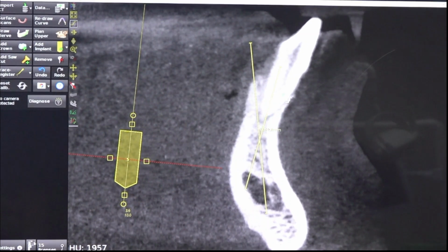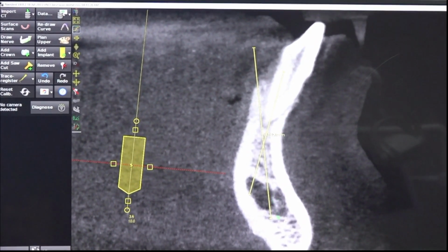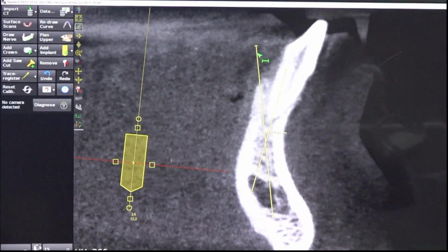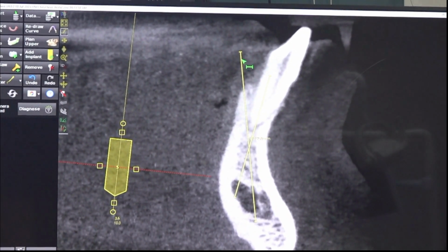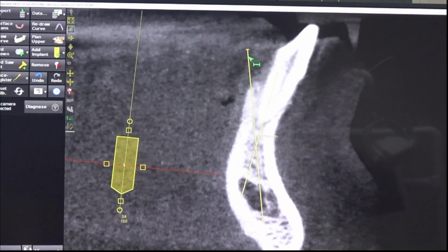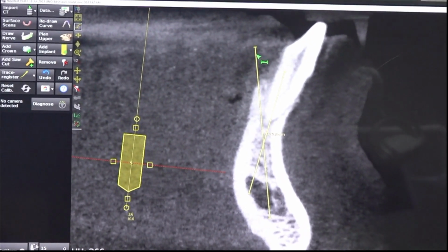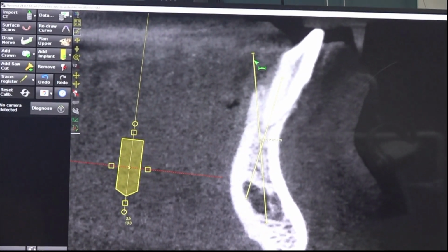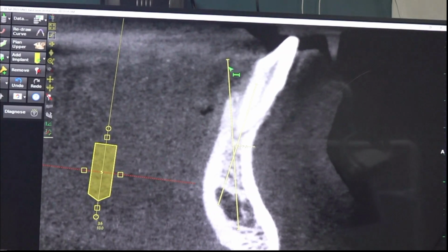But if you see between these two drillings, the abutment location is better when you go along the apex; the abutment will come in the correct position. But after alveoloplasty, if you drill, it will come very lingually. That is why in full mouth patients, the lingual part of the prosthesis is bulky and the patient has difficulty, because the alveolar bone loss happens and we also do alveoloplasty. The moment the alveolar bone is not present, the drilling angulation changes and the abutment goes lingually. Then the prosthetic challenges will come.